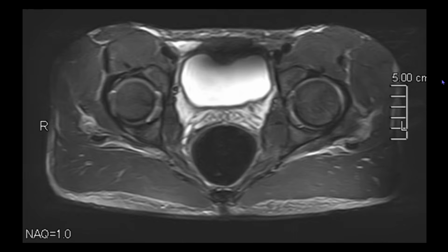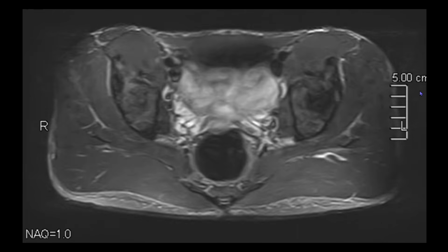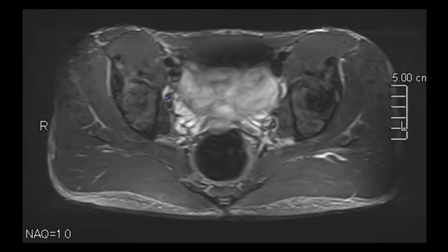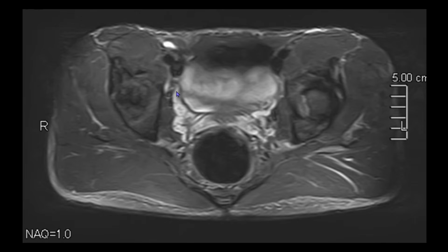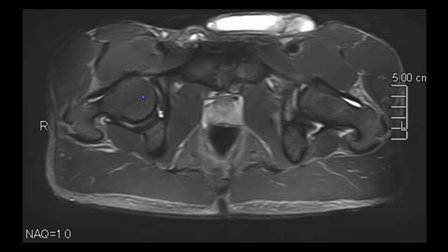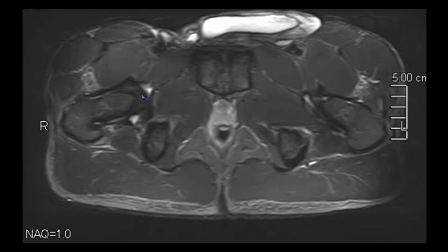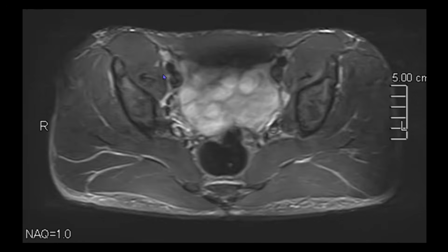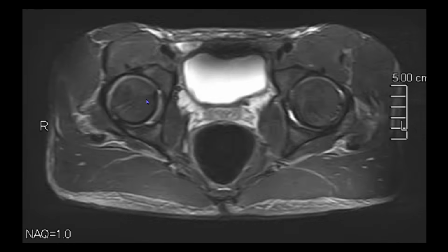On the left side, we see it coming onto the anteroinferior iliac spine and attaching like this, but on the contralateral side we are seeing some amount of cystic changes which are occurring at the site of the attachment at the anteroinferior iliac spine, and this rectus femoris tendon appears thickened. So this might be correlating with a prior injury. However, no edema is seen, so this does not seem to be an acute injury. This is just a sequelae of prior injury.